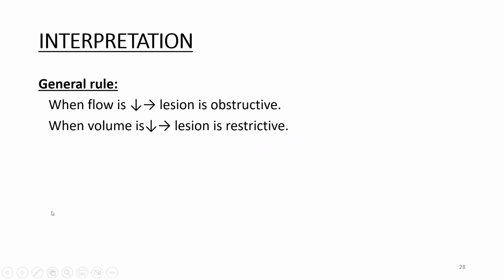General rules: when flow is decreased, the lesion is obstructive. When the volume is decreased, the lesion is restrictive. So the obstructive pattern is a diminution of flow.